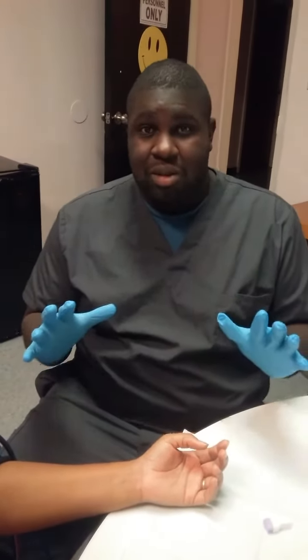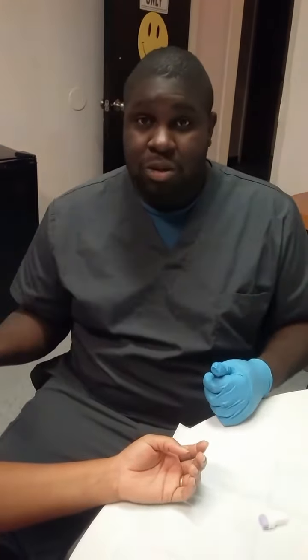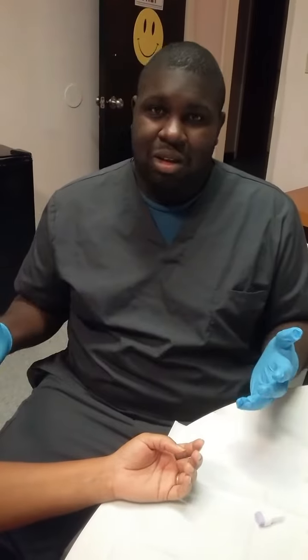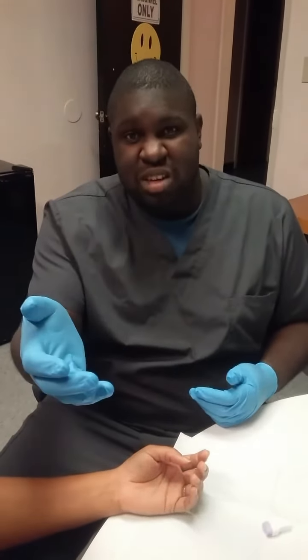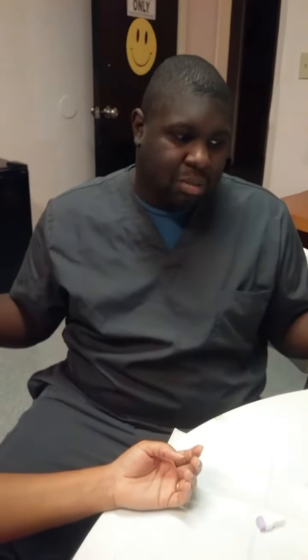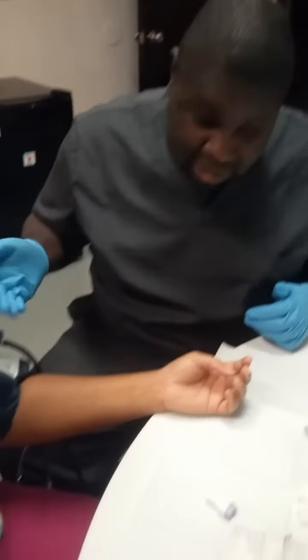Now there are some diseases that may cause an abnormal bleeding time, like leukemia, myelodysplastic syndrome, and other things of that nature. Vitamin C deficiency, alcohol intoxication, other factors like that could cause a high bleeding time, pretty much. Now back to that. Now we see she's done bleeding.